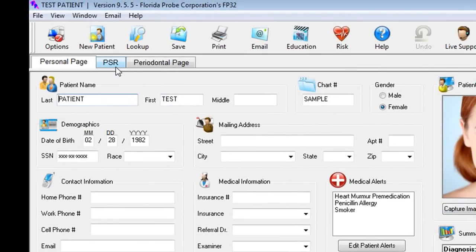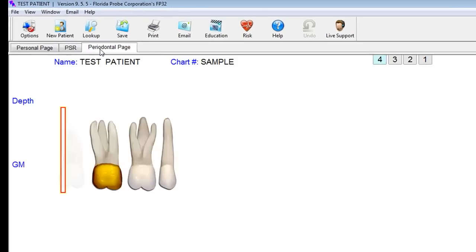To continue on, we would be able to either enter a PSR — a quick screening — or a shortcut exam, or we could do a comprehensive periodontal exam today. Let's go into the periodontal page.